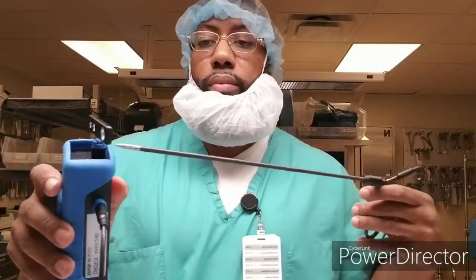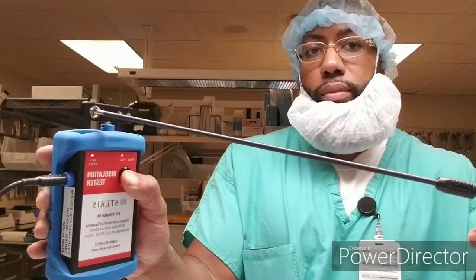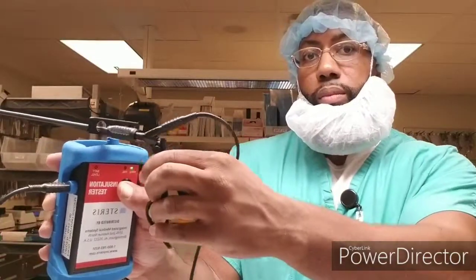The closer the signal is to the metal piece, that means it fails — it's no good. But once it reaches the black layer, the black outer sleeve, it is good to go. The surgeons need the black outer sleeve not to crack. So as long as it gets past that black sleeve, you're good to go. Once you hear a beeping sound, you have to trash it — throw it away, no good at all. That tester is generally used for the handles and also the outer sleeves.